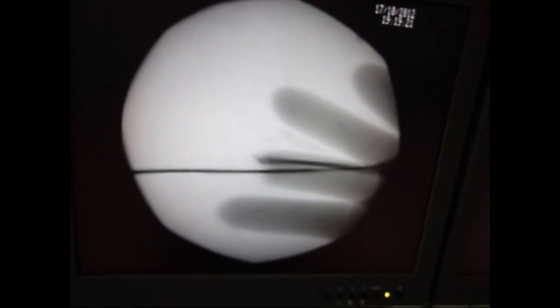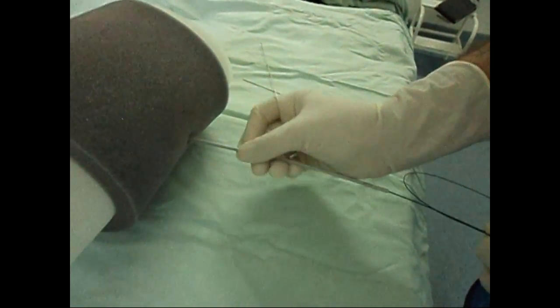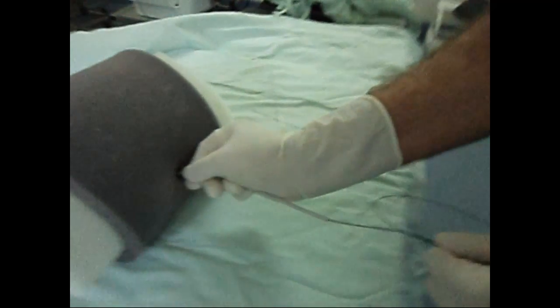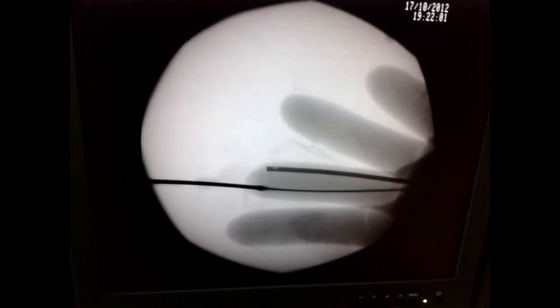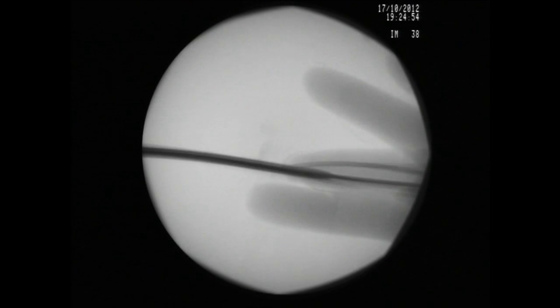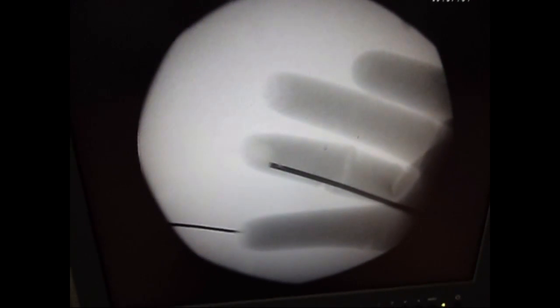Insertion of the guide wire follows. Sequential dilation is performed to 12 French, then using metallic dilators. Amplatz dilators up to 14 French are used. Likewise, all the fingers of the glove can be punctured to practice multiple access sites.